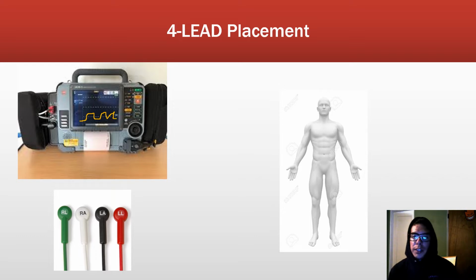So it'll do stuff like that, and based on that you can tell if they're moving air in and out well, and you can also tell cellular metabolism. And for someone who's experienced in reading that and understanding that, you can tell a lot of stuff. In fact, it's one of our requirements to be able to discontinue CPR and pronounce someone dead, is we need to be able to interpret capnography and use that, because if they're dead, their cells are dying, so their cells aren't going to be functioning, and it measures carbon dioxide.